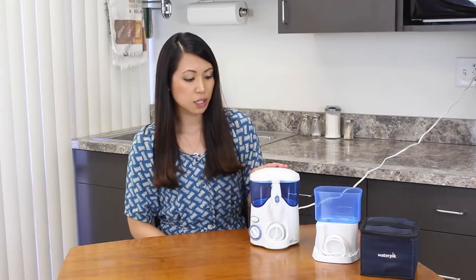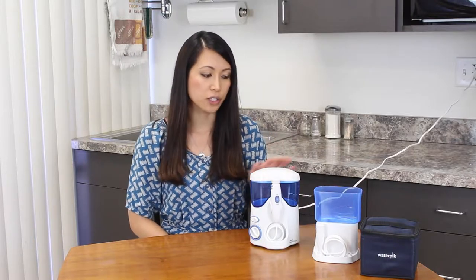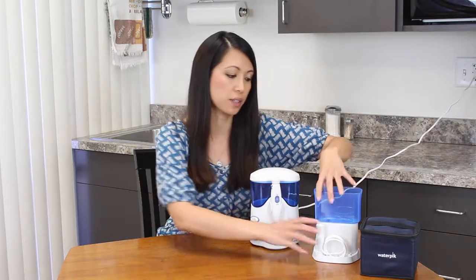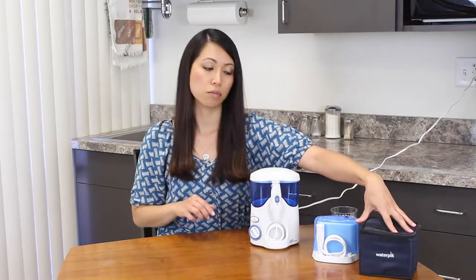And it can also get to the really hard to reach places when you have braces and dental implants. So this product I got at Costco is about $80 and it comes with a travel size that's pretty compact and fits in this little bag.